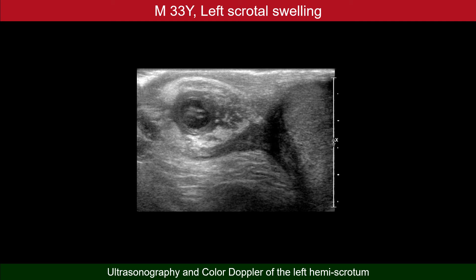Probably the only differential diagnosis at this location is the dancing megasperm. These are moving sperms seen in cases of obstruction of the vas deferens. The dead sperms form a clump in the middle of the dilated vas deferens, and the live sperms move, dancing around this clump.